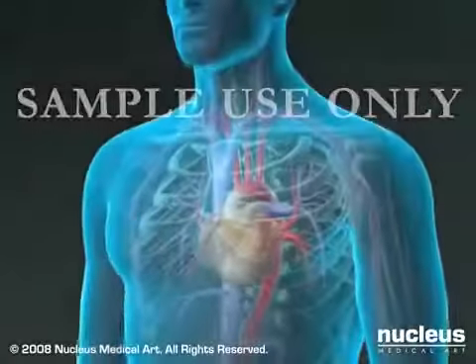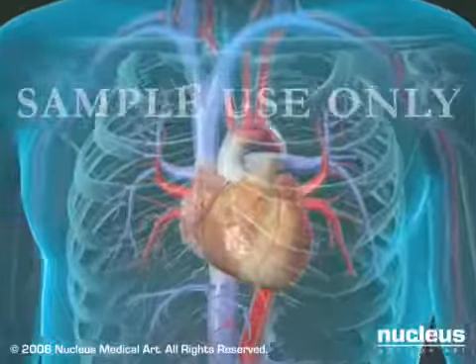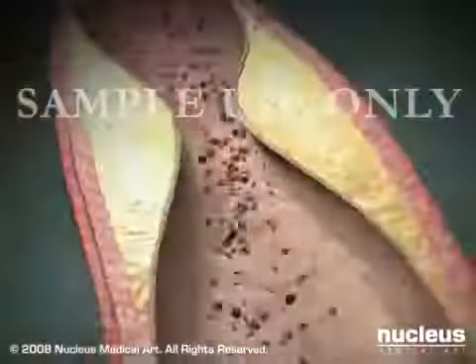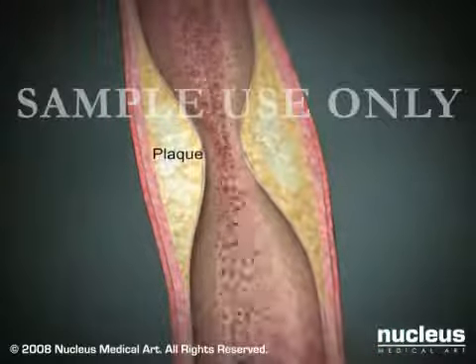Coronary angioplasty, also called percutaneous transluminal coronary angioplasty, or balloon angioplasty, is designed to restore the flow of blood through coronary arteries narrowed or clogged by atherosclerotic plaques, or blood clots.